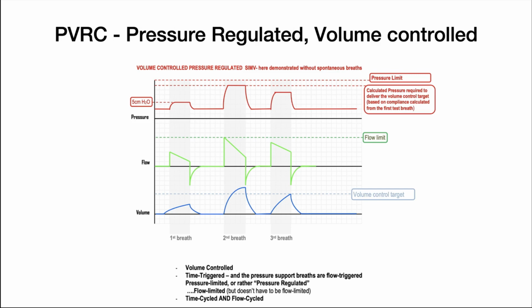Pressure-regulated volume control is a control mode of ventilation that combines features of pressure-controlled and volume-controlled ventilation, and it can be employed with ACV or SIMV. With PRVC, a target tidal volume is set, but the breaths are delivered with a decelerating ramp flow pattern, as in pressure-controlled ventilation. The ventilator provides a breath at a low pressure and then calculates the peak pressure necessary to deliver the set tidal volume. That pressure level is delivered during the next breath.